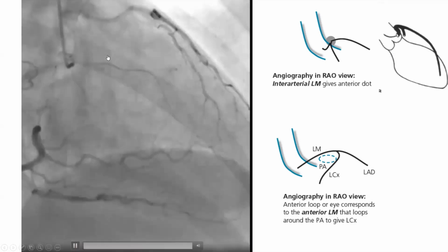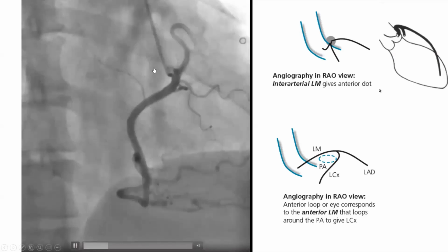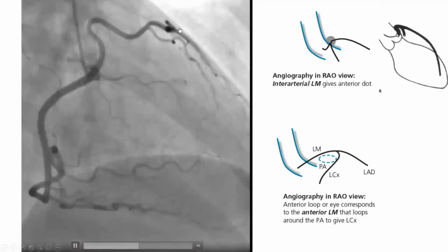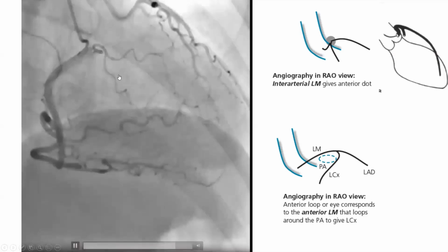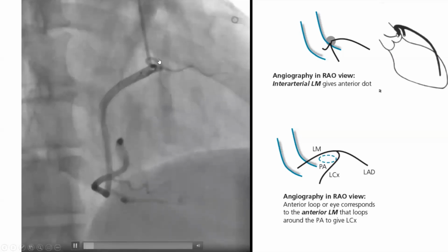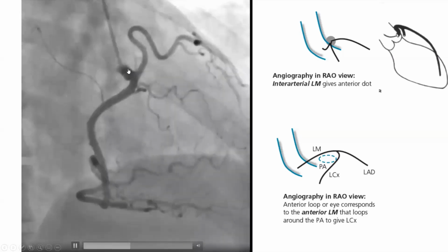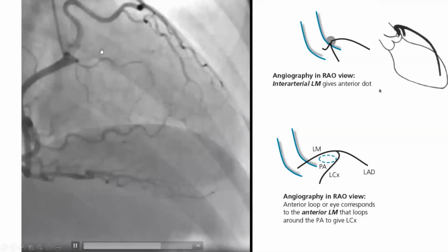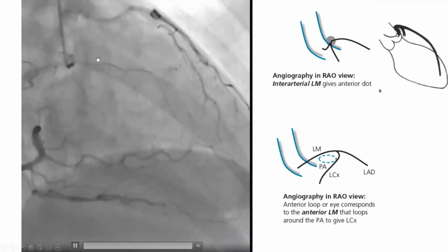Now, what is the course of that LAD? That's an interesting question here. Someone may look and think, oh, it looks like an anterior course, a pre-pulmonic course. I'll tell you, I think this is an interarterial course. It's not the most classic interarterial course, but it is interarterial. This is how it looks, because this is the aorta. You have your catheter and your contrast spill, and you see that tight loop. Whenever your loop is tight or kinked in front of the aorta, this is interarterial.